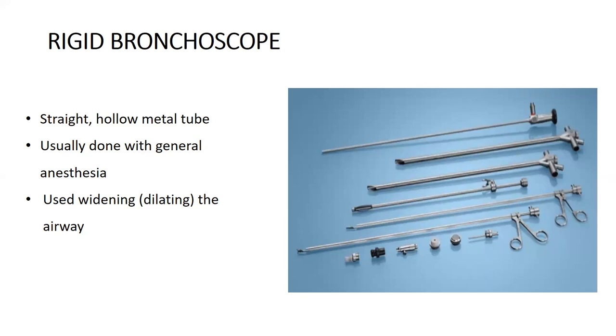Okay, sir. Once you aspirate, whatever you aspirate will go into the alveoli. It will not remain in your major airway for you to visualize and inspect. Yes, sir. When you are washing out, you keep the scope at the segmental bronchi, based on your X-ray and CT findings as to which part of the lung is aspirated. Then you give a saline wash and see that the return fluid that comes back is clear. How much? I don't think there is any particular fixed quantity. There are patients where we have used up to 150, 200 ml saline at times. Not routinely though. So there is no fixed quantity.